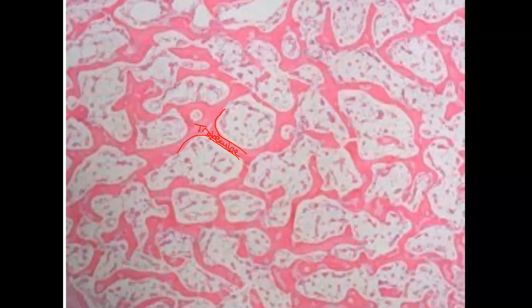Trabeculae, that's plural for that. So those are all little spicules of bone throughout, and within spongy bone. If you remember the cross section of the long bone, the appearance without a microscope, it looks spongy in nature. Microscopically, you're going to see these spaces, and these spaces are where bone marrow will accumulate. So these are called marrow spaces. Okay, so that's spongy bone.